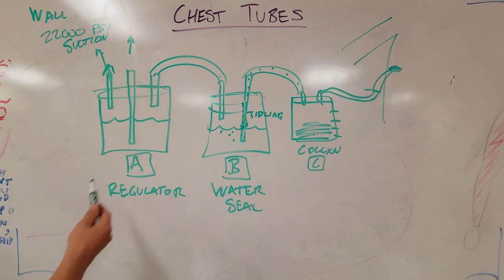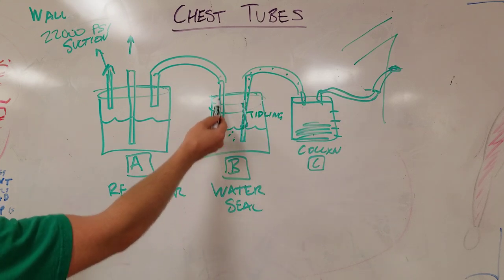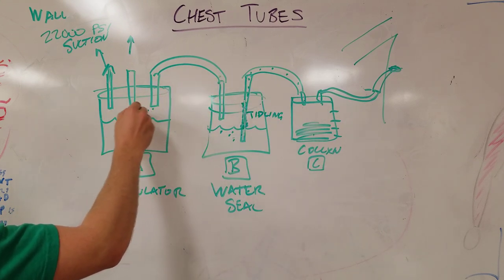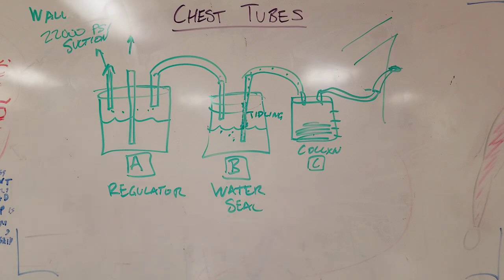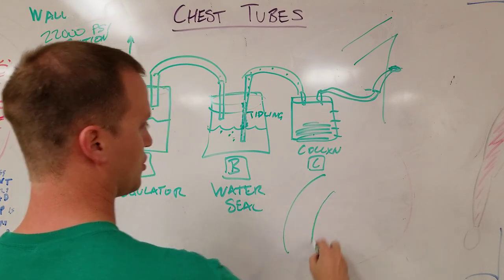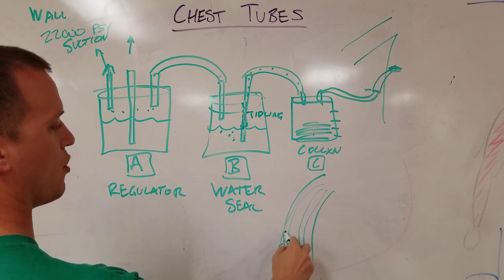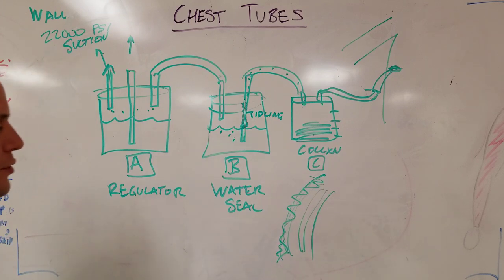Now, what it's gonna do is pull air in line, right? We pull air from here, too easy. We bubbled it through, we pulled air through here. We're gonna bubble across, but eventually in this guy's chest, the pneumothorax is gonna be all gone, right? Let's say this is his chest and his lungs started way down. Over time, as you're sucking on it, boom, boom, boom, there's gonna be no air left. The visceral and parietal pleura are now well opposed like they're supposed to be.